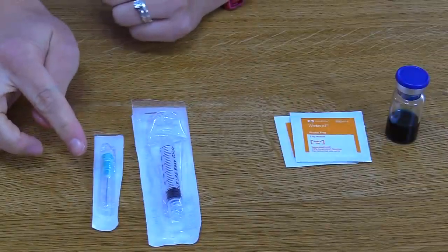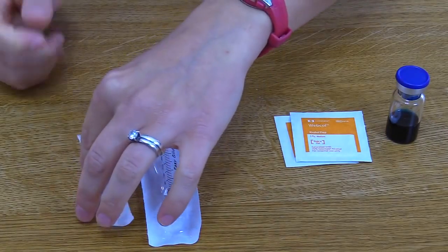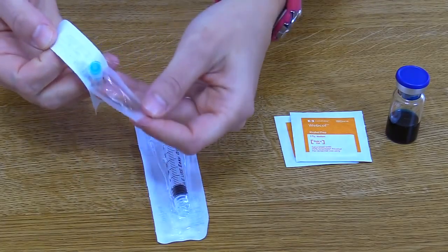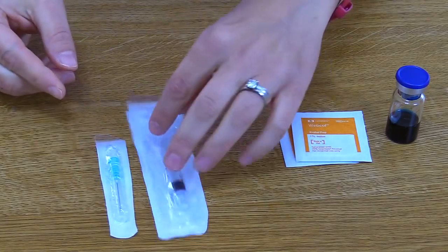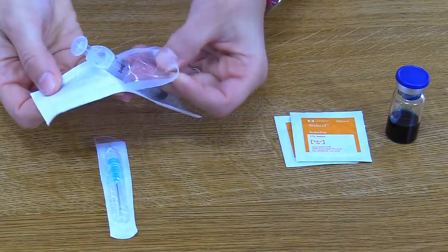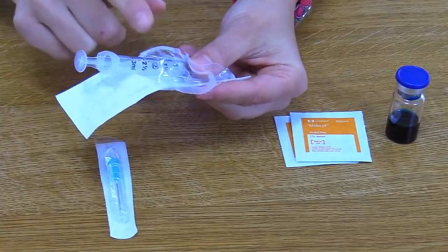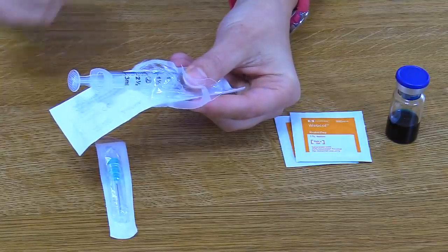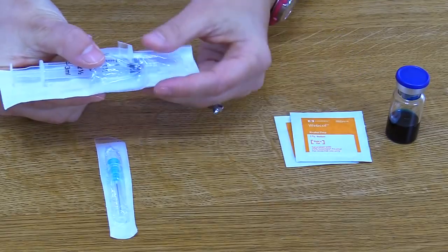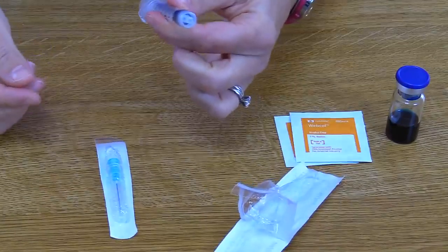So we're going to attach a regular needle to the syringe's needle adapter. First, I'm going to open up this packaging of the needle, and I'm going to leave it in there. Then I'm going to open up the packaging of the syringe, and one thing about the syringe that you want to remember is that you only want to touch the plunger flange and the barrel. You never want to touch the shaft of the plunger or the end of this tip, because you can contaminate your syringe. So we're going to take it out, and I'm going to hold it at the barrel.